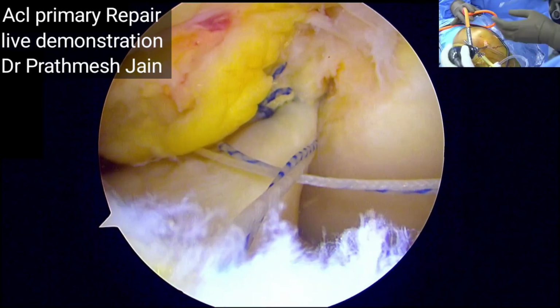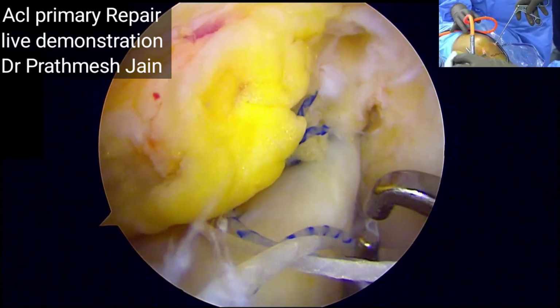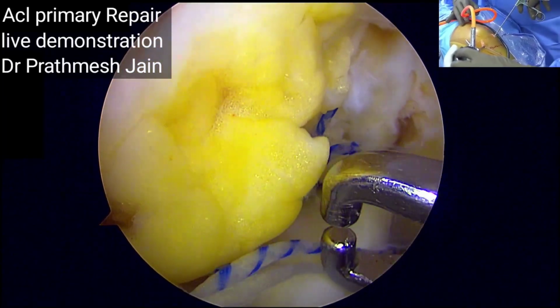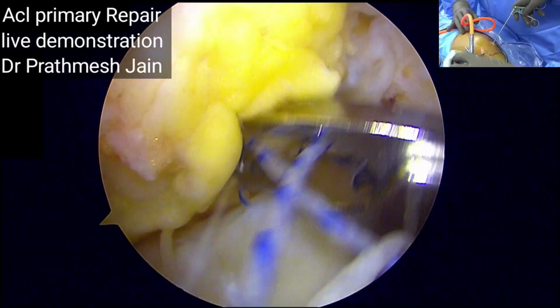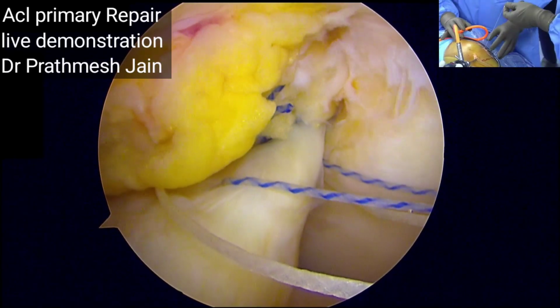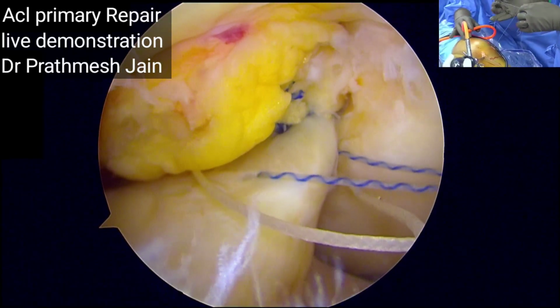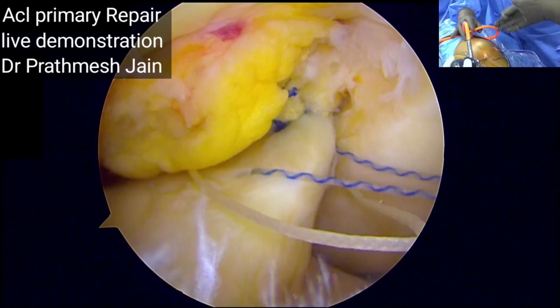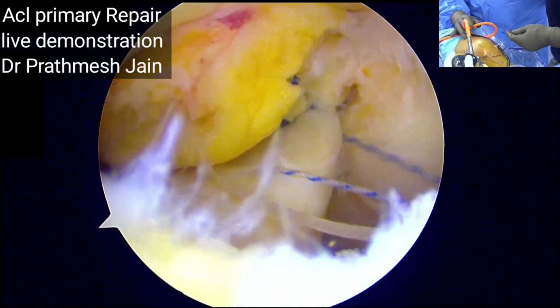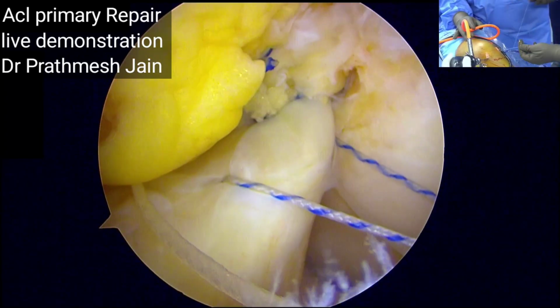That not only reduces the chances of inflammation but also reduces the chance of actual infection, because we don't want unwanted material there, because the body heals. If the body is healing naturally, we don't want any extra thing to aid it. So that's why in this particular technique we are not recommending the use of the internal brace technique. If you are doing this technique, this technique alone is sufficient. You don't need to do an internal brace associated with that, and that makes it a very safe surgery.